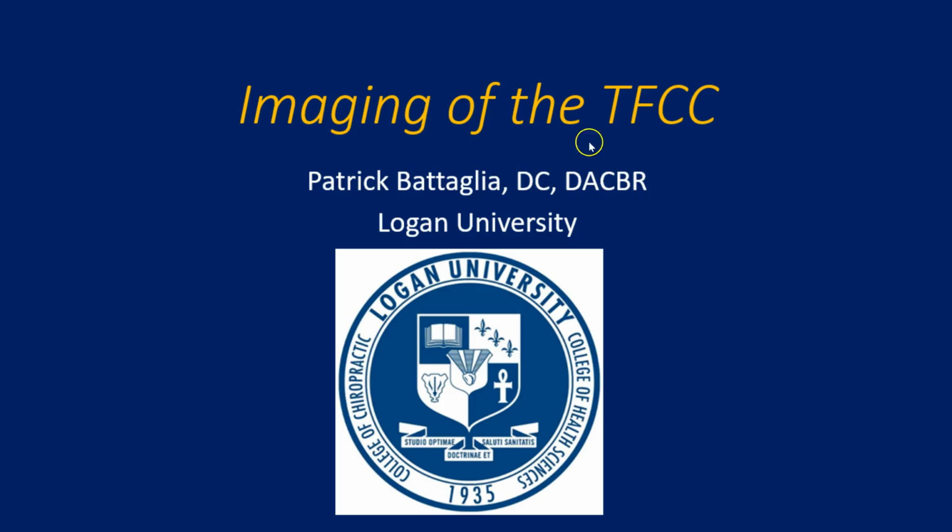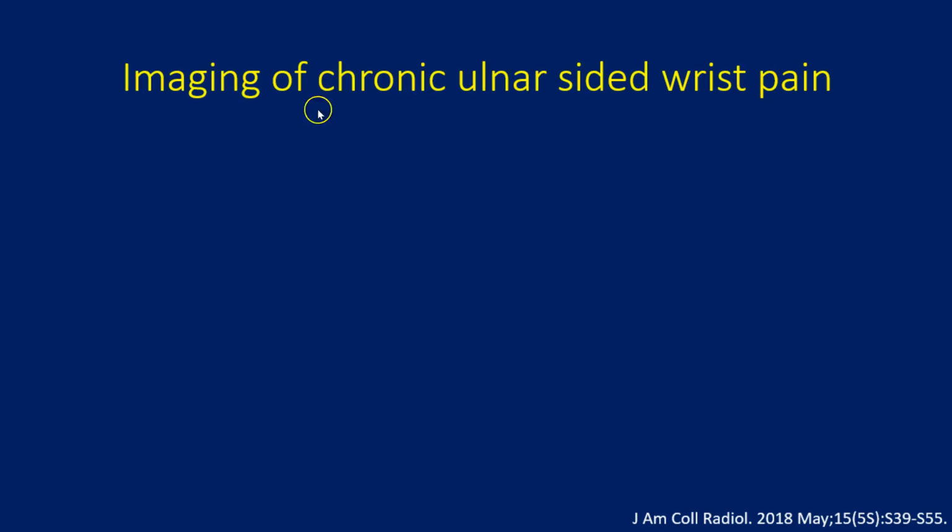This is imaging of the triangular fibrocartilage complex. I'm Pat Battaglia at Logan University. A little bit of background on imaging of chronic ulnar-sided wrist pain.